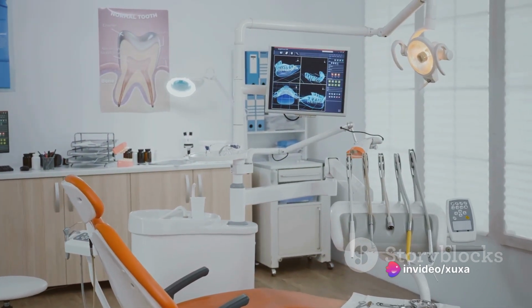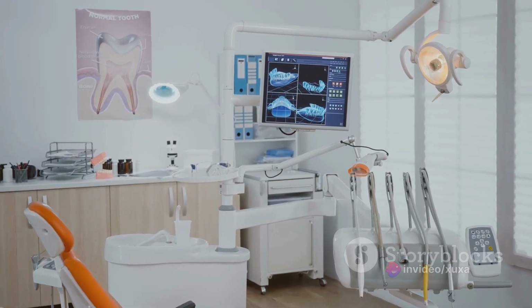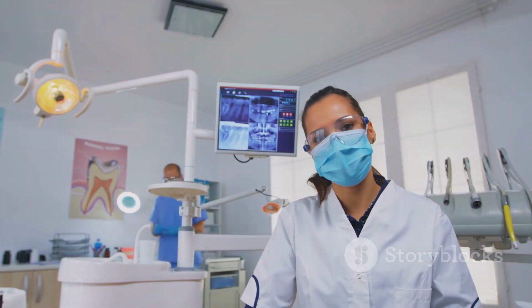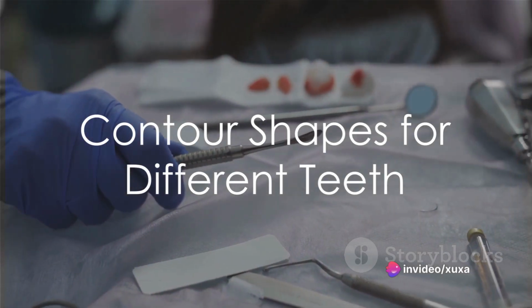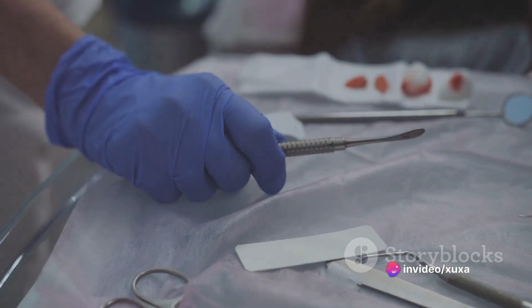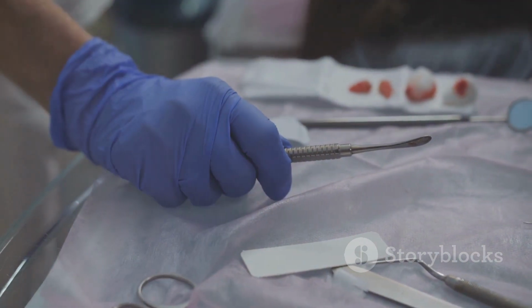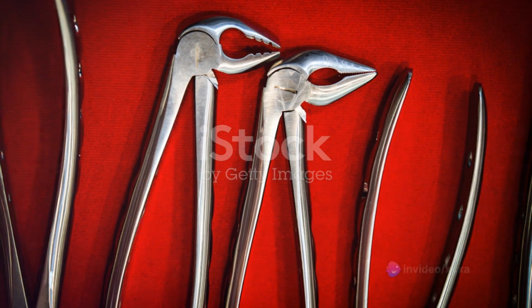The operational sequence includes radiographic planning and clinical examination, establishing the preferred area, contour shape, trephination direction, and cleaning and antisepsis of the cavity. The contour shape varies depending on the tooth. For instance, upper and lower central and lateral incisors have a triangular shape, with the base towards the incisal and the vertex towards the cingulum. Upper canines have a spear shape, with the smaller tip towards the cervical.